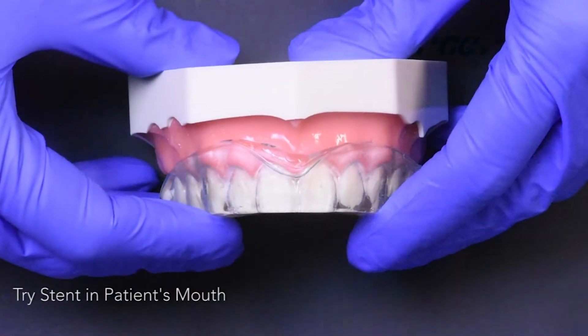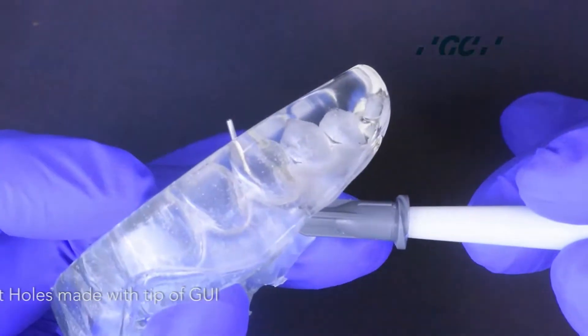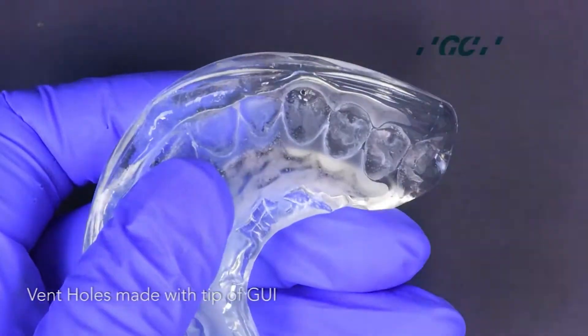The clear stent is checked for fit in the patient's mouth. Next, create vent holes in the stent with the tip of the G-Aneal Universal Injectable Composite.